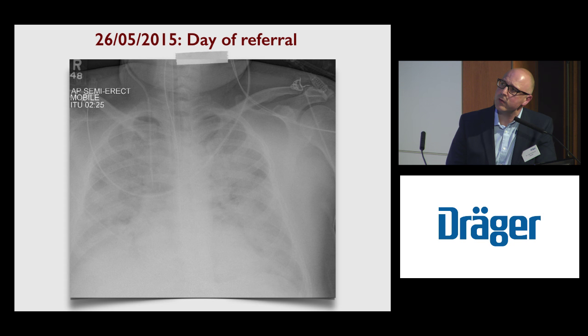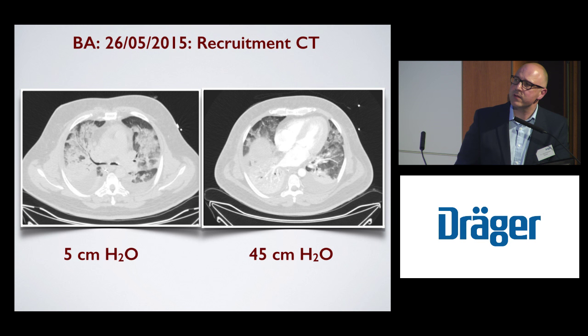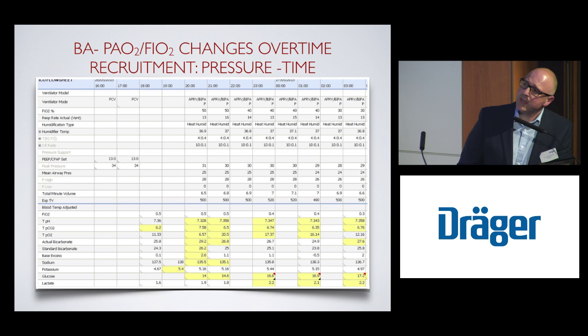And that was his recruitment CT. So that has 5 centimeters of water and 45. And you will agree that there is minor recruitment within 40 seconds of high pressure. But again, after a few hours, he improves and clearly responds fairly quickly to APRV in terms of oxygenation index. And you can see here that from 13, it goes up to 42.